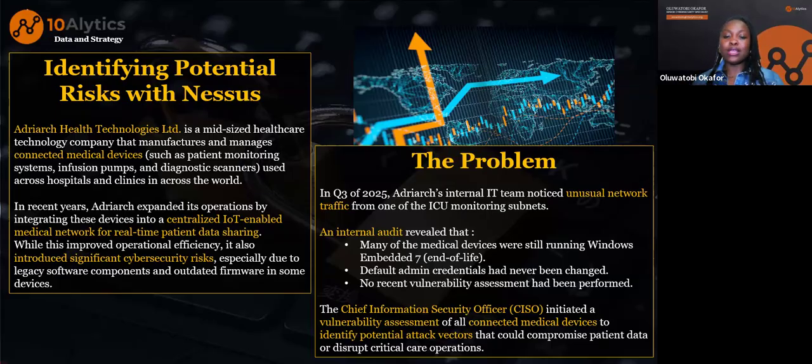Okay, so like I was saying, right, we refer to these kind of devices as legacy devices. What that means is that they should never be connected to the internet. If at all they have to be used, and they need to see the internet, then there has to be a need to change or upgrade their firmware and their software.